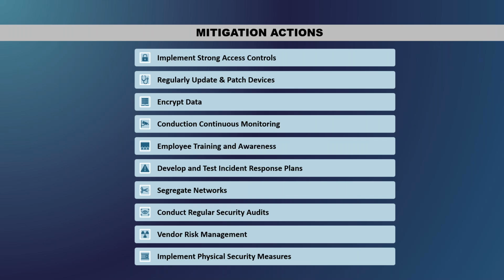So implementing strong access controls, using multi-factor authentication if it's available or if it's allowed, restricting access based on user roles and responsibilities. Making sure you're regularly updating and patching those devices, ensuring that all the devices have the latest firmware and software updates, and automating the patch management process whenever possible.